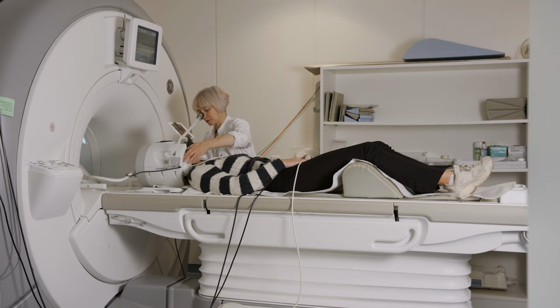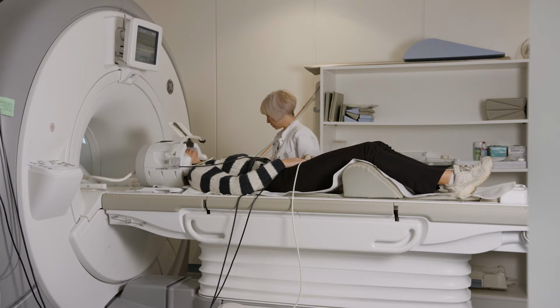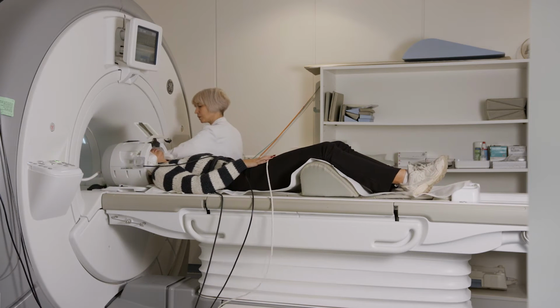To measure stress in the brain, we have to do mainly two things. First, we have to elicit stress in a suitable stress test, and we have to try to obtain information directly during the stress experience. We are doing this by performing a stress test in the fMRI scanner and obtaining a lot of parallel signals.